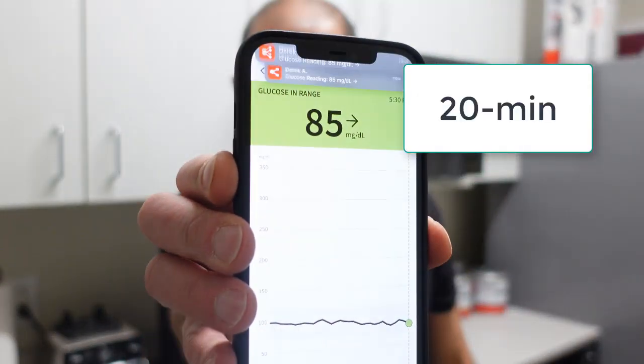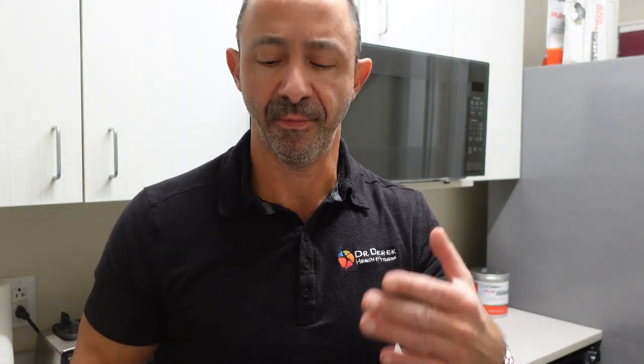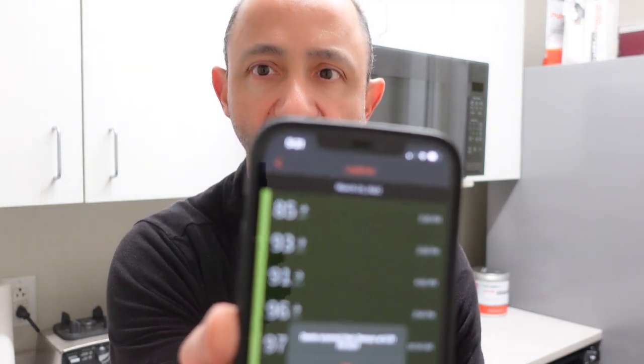Okay, it's been about 20 minutes and 85. In fact, the number even went down a little bit. Yes, my body did release some insulin, and relatively fast. It wasn't up for any length of time, so I could see that my glucose decreased 12 points thus far. I apologize. I know I said my glucose decreased 12 points. It's actually only 8. I guess I'm not that good at math right now, although that yogurt must have gone to my head, but I'm down 8 points so far. Still, it's because I released a little bit of insulin, but not that much, so let's keep an eye on it.